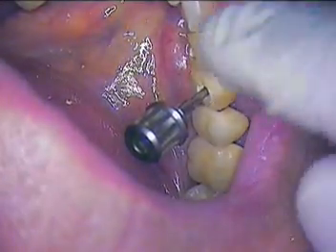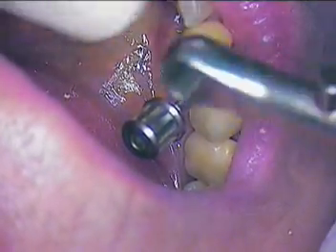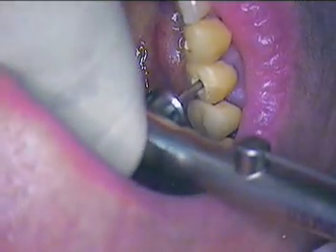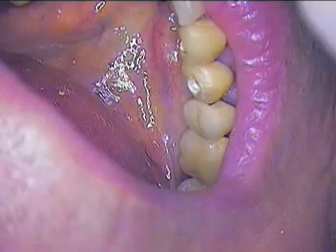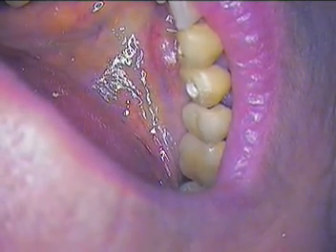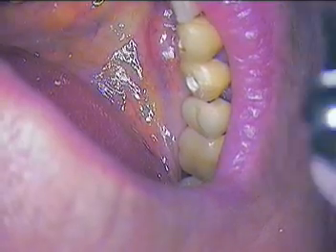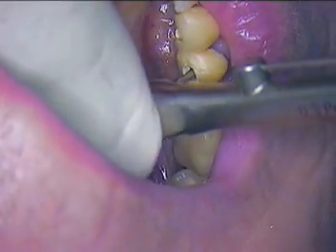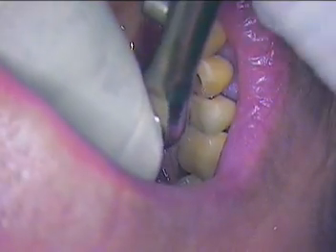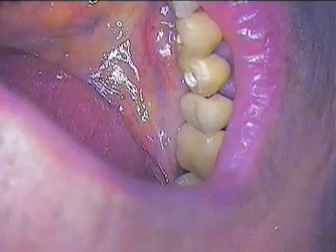Now I'm going to back out. You can see we've got a screw that's on pretty tight, so we're going to use a little wrench — it comes with the kit. A lot of times the surgeons will just hand-tighten these temporary abutments. This one was a little tighter, so we have to use the wrench and some resistance on both.